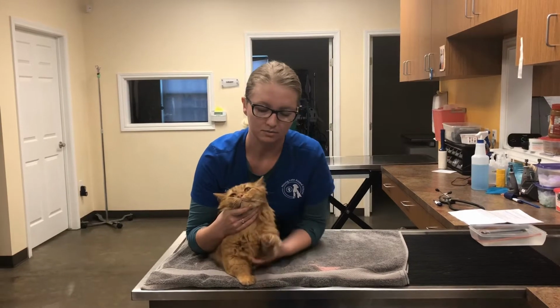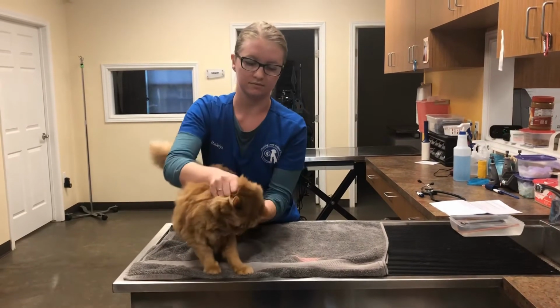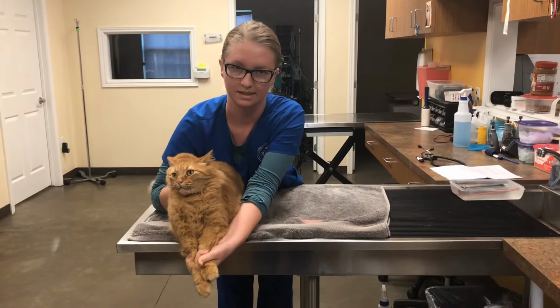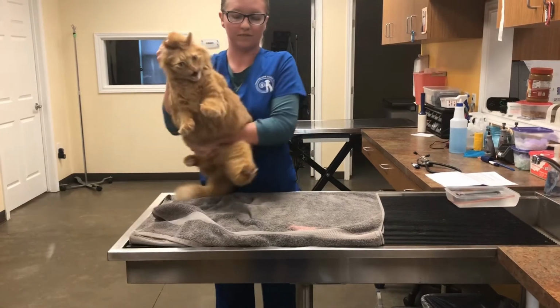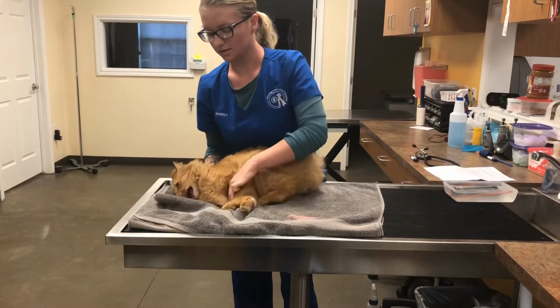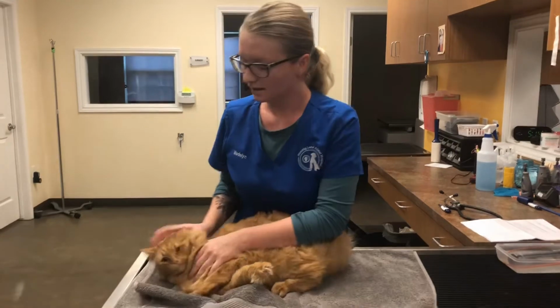You can also put them over the table and extend the limbs down to get better access to the jugular vein. You can also do a jugular blood draw on their side laterally. So I would hold these limbs out of the way and then push his head up, which would give you access to the jugular vein that way.